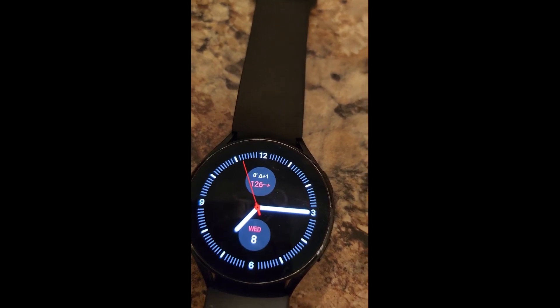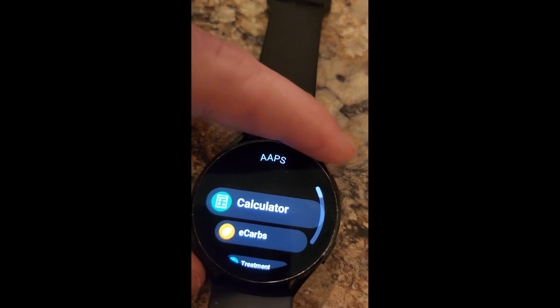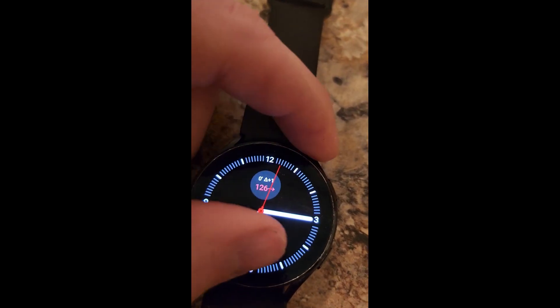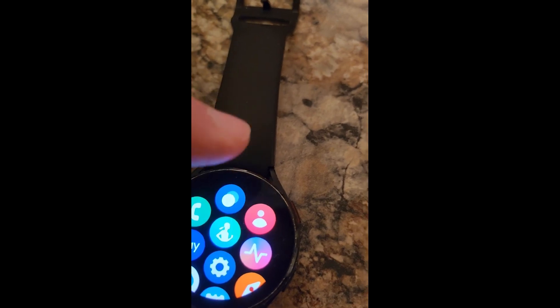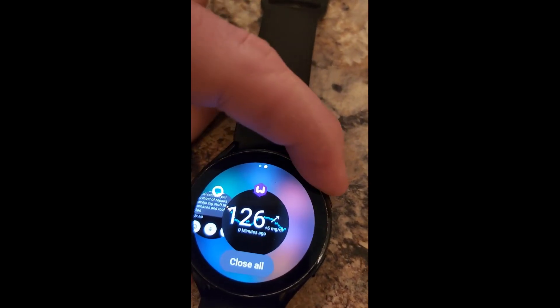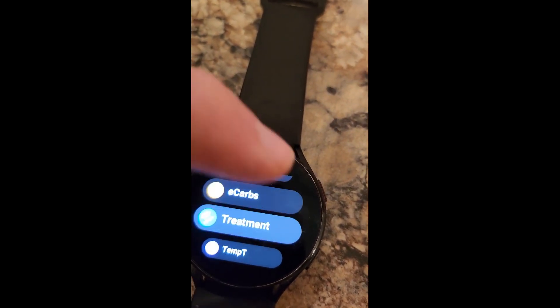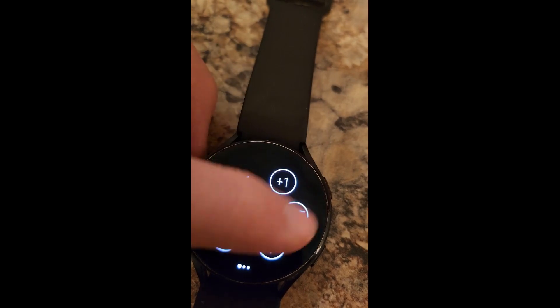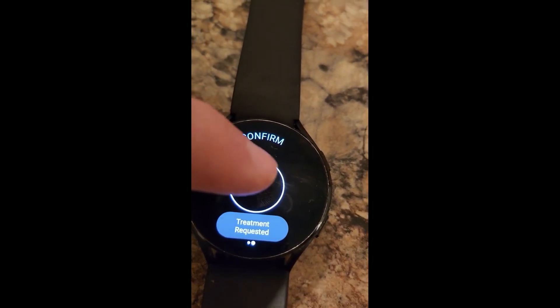And sometimes this will happen — this is tip number one — sometimes it'll act like it's trying to do something, but then nothing actually happens. So what you do if that happens is just clear it out of the recents. Go back, and then it'll always give you the confirmation notification.